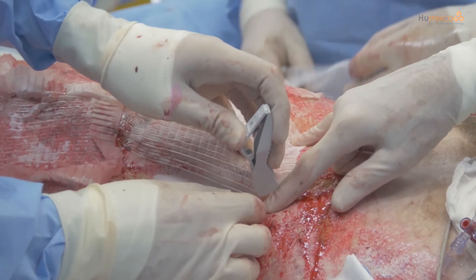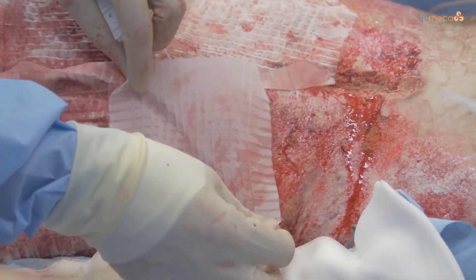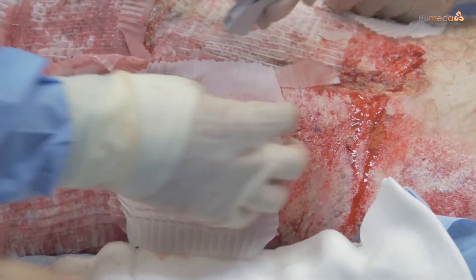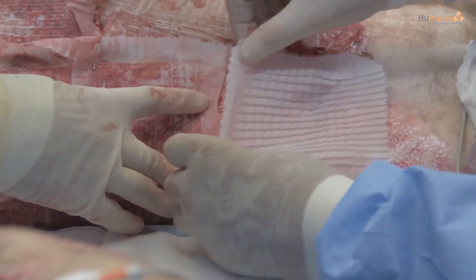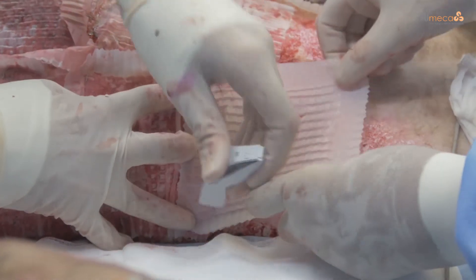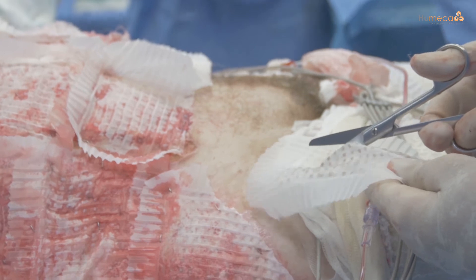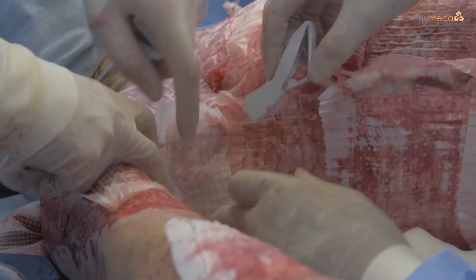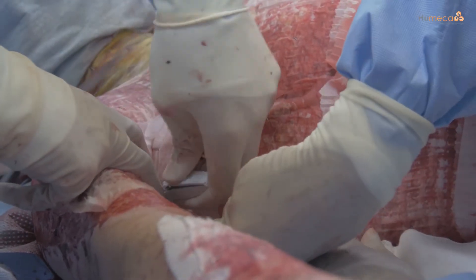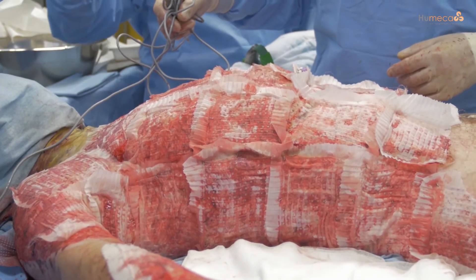After the usual wound bed preparation, the gauzes are placed onto the wound bed and secured with staples, making sure that there is good, even contact. Apply the gauze graft side down to the wound bed, stretch the gauze working corner to corner, and flatten it to ensure optimal contact between the skin graft and the wound bed. Secure with staples and fold back the edges of the gauze. Gauzes should be placed close to each other and aligned to prevent additional scarring in between. The permeable nylon gauze acts as a carrier for the graft and also helps protect from shear. Gauzes can also be trimmed to fit difficult areas. The graft islands adhere very well to the gauzes and handling them is very easy, in contrast to the trouble in handling of some widely expanded mesh grafts.